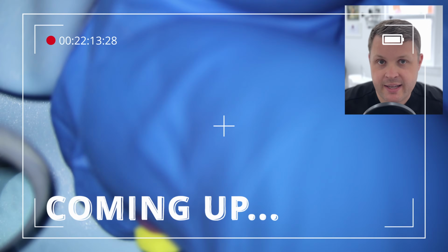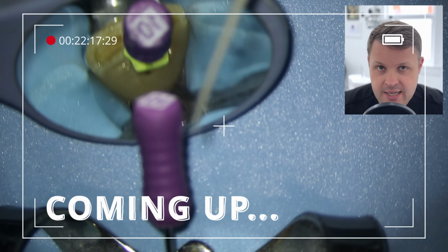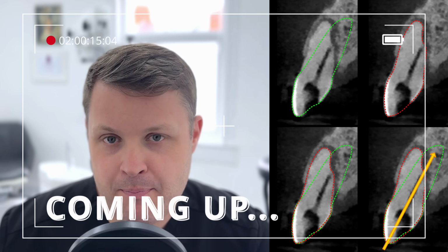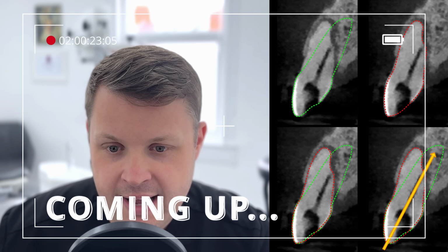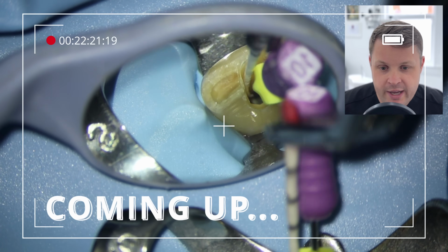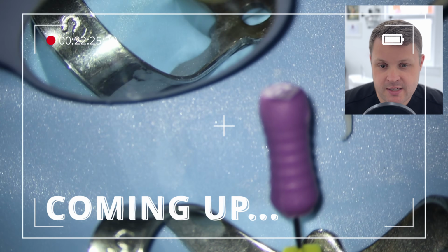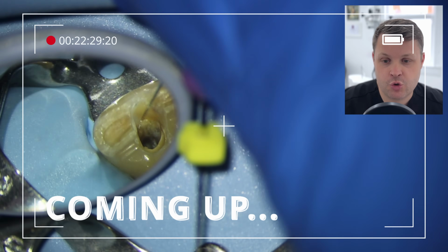Around, and straight away I find the canal orifice. So it just takes that kind of orientation to have a little feel around. The tooth is slightly unusual. I think it's a little bit bent, and I'm just going to annotate here on what I think the tooth should look like compared to what the tooth does look like. So I do want to wick out some of the irrigant here, because when I hook up the apex locator, I'm worried that the perforation palatally is going to short circuit this.